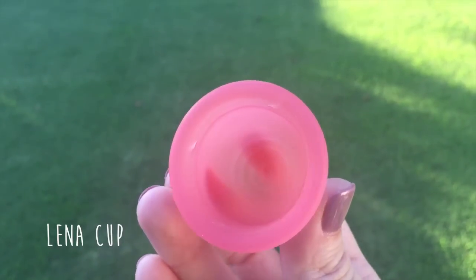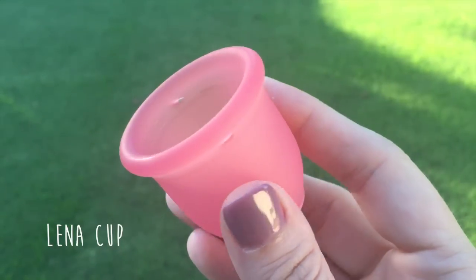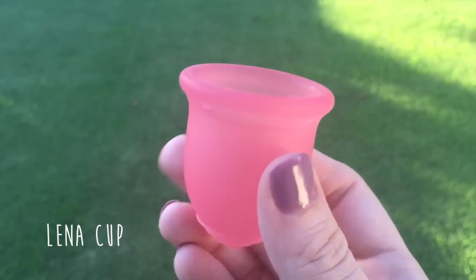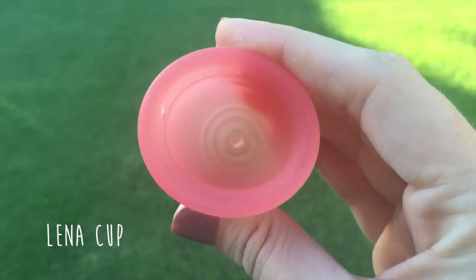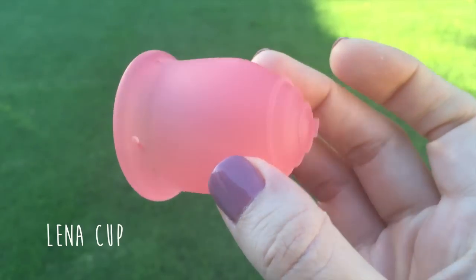Next we have the Lena Cup size large, made in the USA. It is made from medical grade silicone and is only offered in pink. The diameter is 45 millimeters, the length is 50.7 millimeters, and the capacity is 30 milliliters.